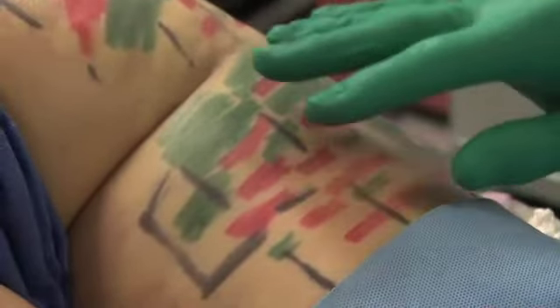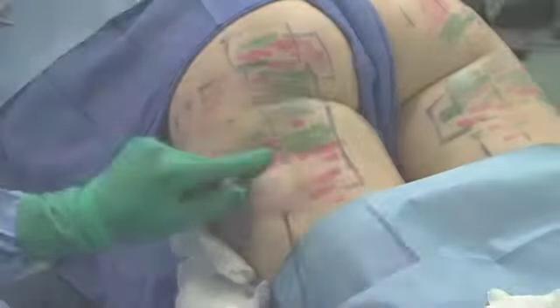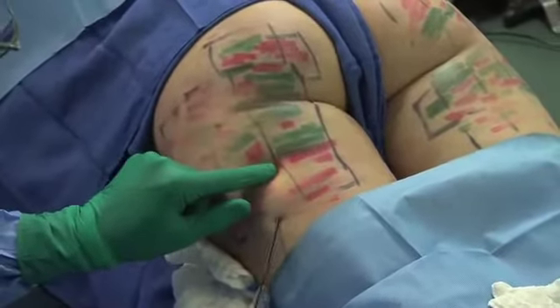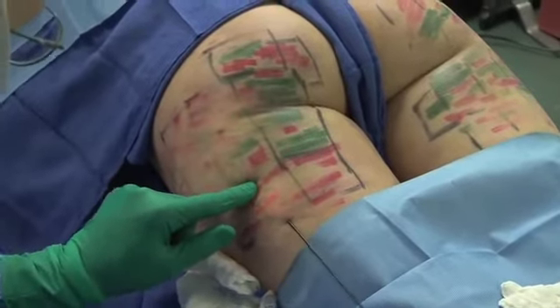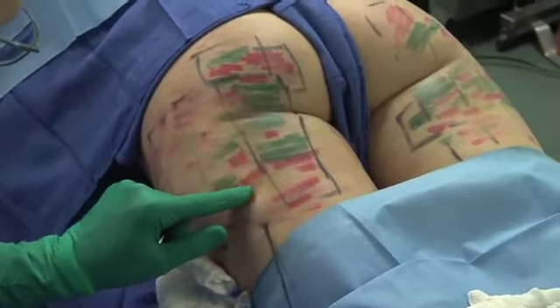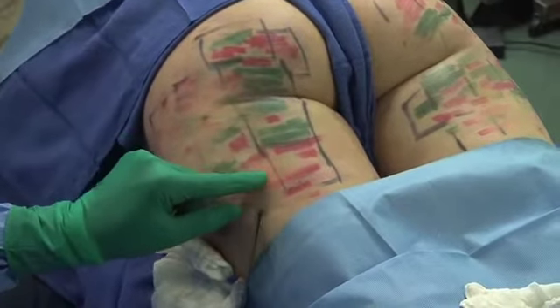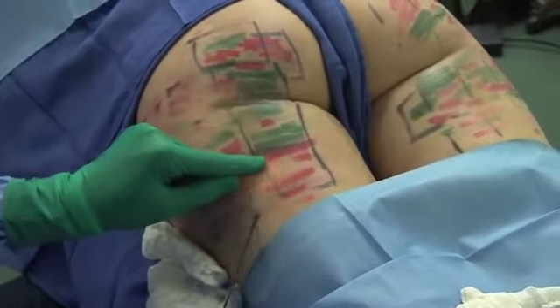Inflammatory processes, some of the scar tissue formation, and some of the thickening of the skin are going to be an additional improvement in this area as well. This is a sculpting procedure. Liposuction itself is a sculpting procedure. Because I paint and I carve and I sculpt, and I've been doing that since I was 8 years old, I bring that aptitude to the table. It's a very fine kind of sculptor. When you think about taking a surface that has a marbling or a texture or kind of a cobblestoning and saying we're going to make improvement, you've got to be very precise. You've got to be very delicate in your application of your sculpting principles. And when you do that, you can see that kind of result.